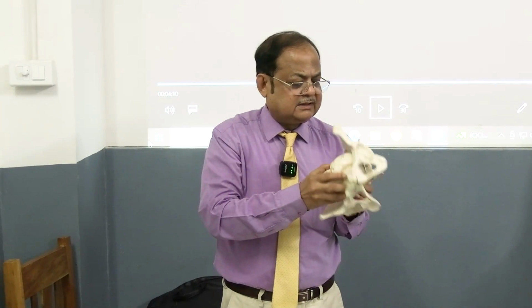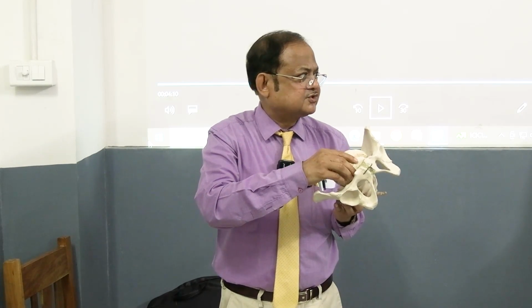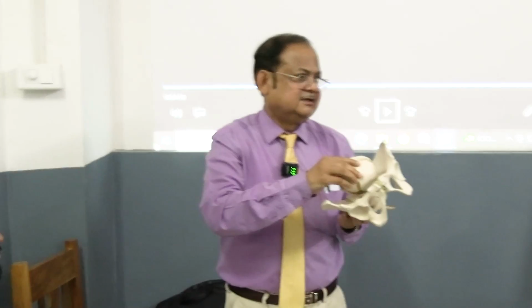Asynclitism means the sagittal suture is displaced either anteriorly or posteriorly, and midline means synclitism. With correction of the asynclitism there will be less slipping, that is, the cup detachment will be less, and traction will be less. Minimum traction will be needed later.